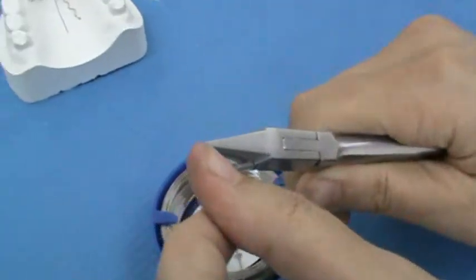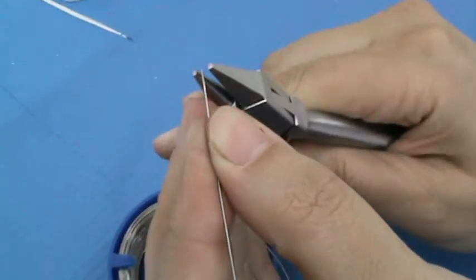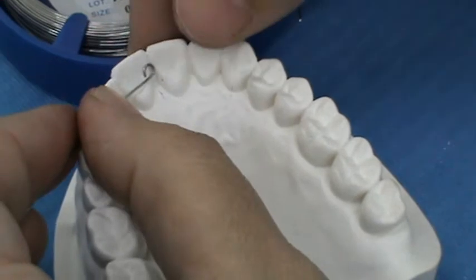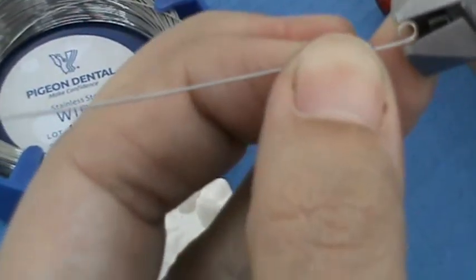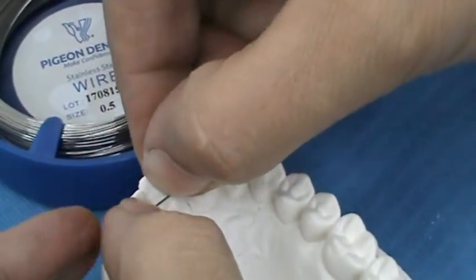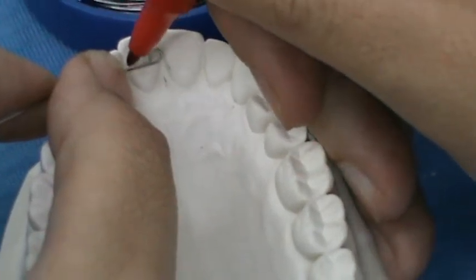We are going to start by straightening the wire, holding the wire with the pliers and pulling the wire. We will then make the atraumatic end, which is a small coil. If it is open, we can make squeezing by using the Adams plier. The active arm width should match the mesiodistal width of the tooth to be moved, so we are going to measure the width of that tooth.